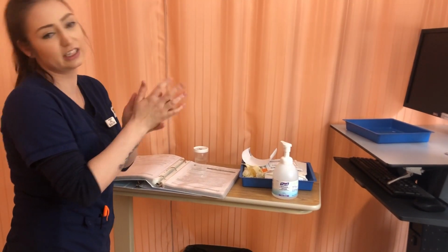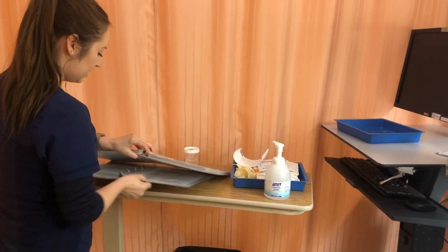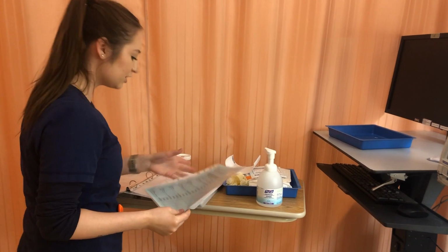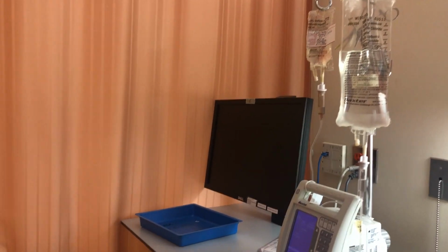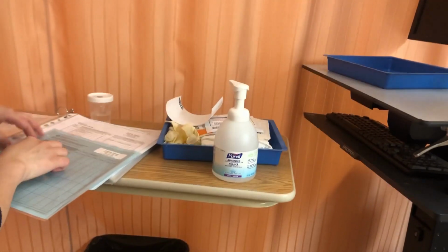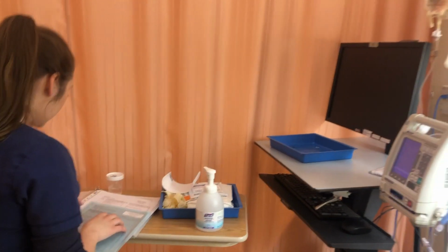So, my buddy nurse has prepared the mini bag and hung it at the bedside for me. I've just got my physician's order to my MAR, and I'm also going to be looking at my mini bag there. So for first check, Bryson Scotlan, I have Bryson Scotlan on the mini bag. Right drug is Insulin Humulin R, and that is Insulin Humulin R.